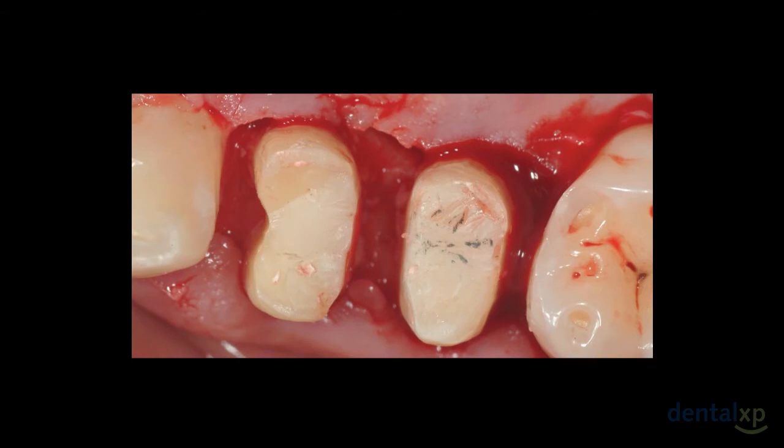Looking straight down this tooth, this is a post-shaped tooth that was done incorrectly. This was done by a periodontist who looked at this tooth and thought of how he would handle a molar and burrowed in the concavity, thus creating a worse situation than if he had left it alone.